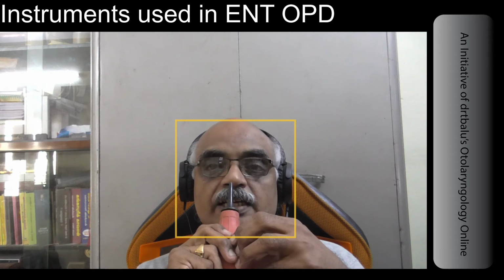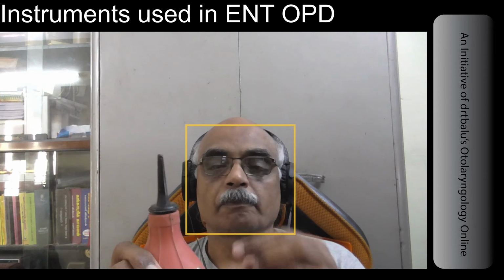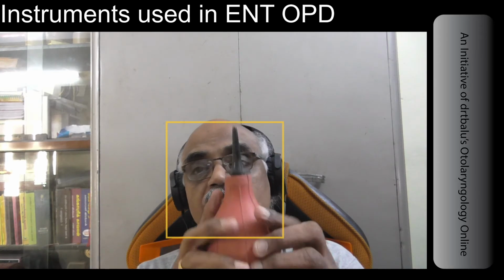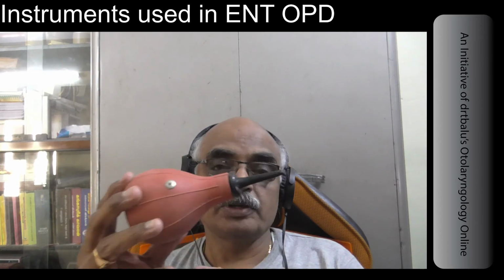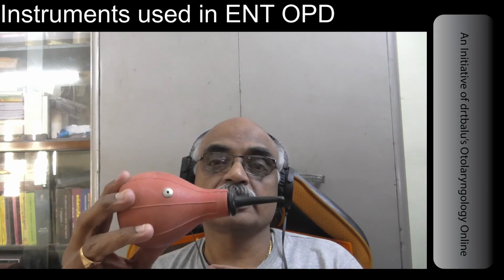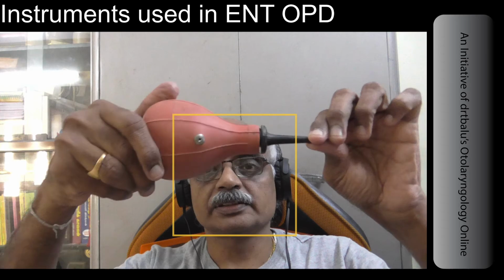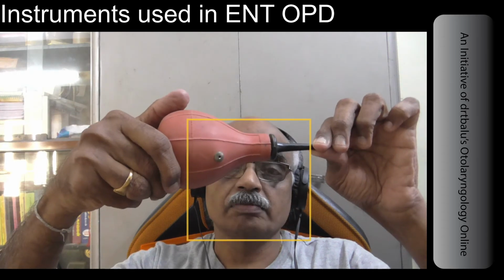When the patient is saying KKK, you press the bulb. It will pump air into the nasal cavity, and from the nasal cavity via the eustachian tube, the air will get into the middle ear cavity. So this Politzer bag can be used effectively to ventilate the middle ear cavity. Just have a good look at the Politzer bag. This is how a Politzer bag looks.